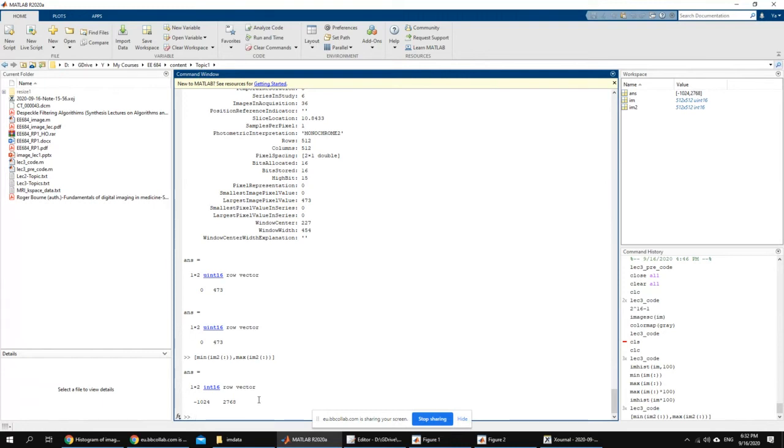They are relative: the relative percentage difference between the attenuation of that part of the image and water. If you have something denser than water, like bone, it's going to be positive. If you have something like air, much lower than water, you're going to get a negative number. So the values for CT are usually down to -1024, which is basically for air.